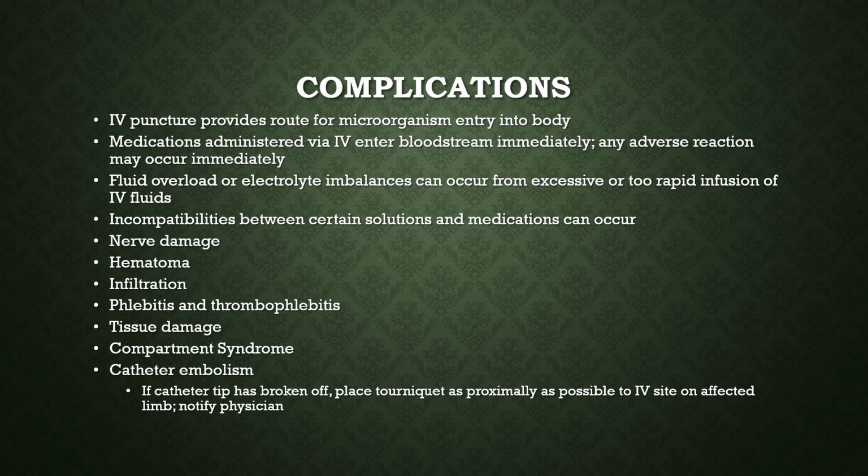Usually the patient will complain of pain, although not always. But you'll see an extremity that's very cool to the touch. If it's full of fluid, it'll be very cool, tight, shiny. The IV may beep because it's not running. It may be really puffy. Anytime that you see any of those things gives you an indication that the fluid is not running in the IV space but into the soft tissue. IV must come out.